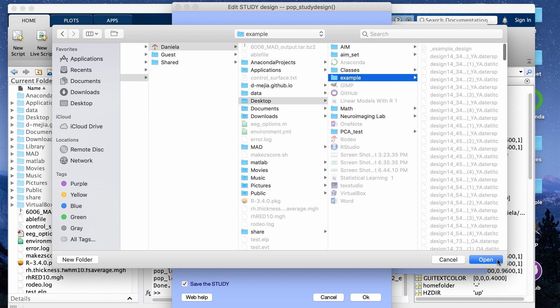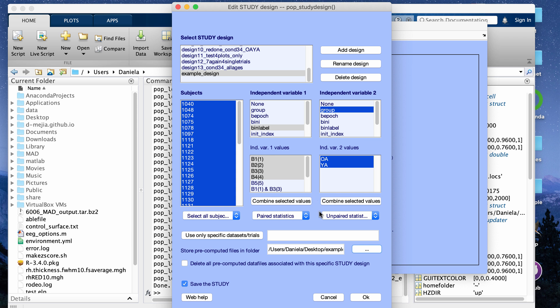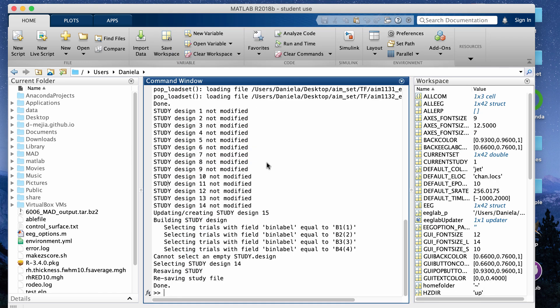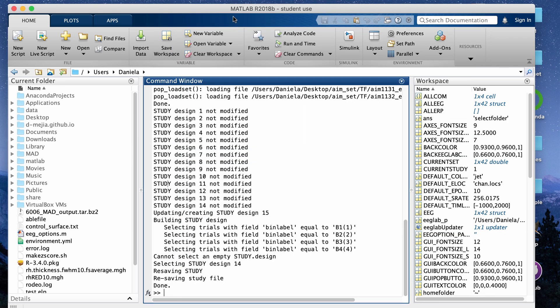You select the folder where you want the pre-computed results stored and click Open, save the study, then click OK. Clicking OK saves your study design, which is confirmed in the command window.